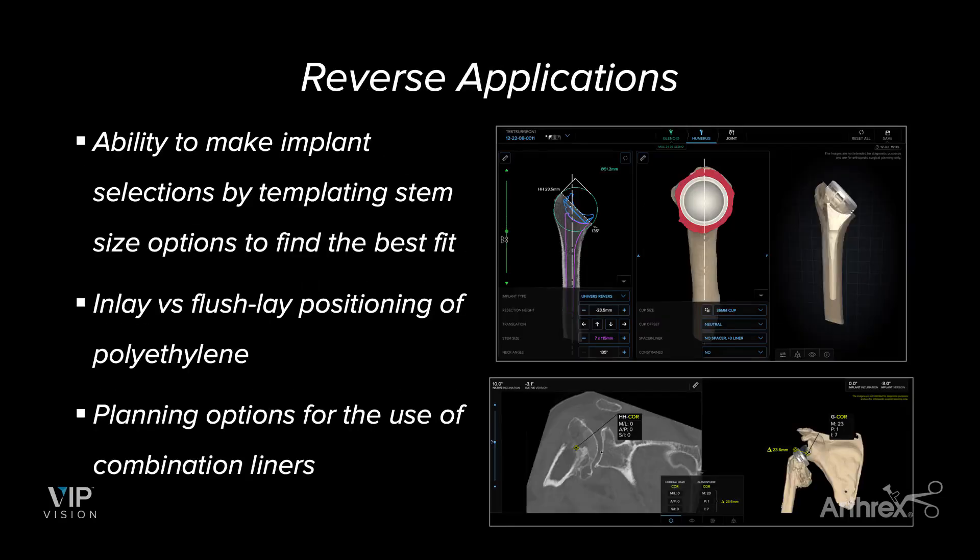Even in terms of reverse applications, it helps you understand which size you should be using for your stem, whether it's a short stem or a long stem. It can also tell you how deep you want to inset that stem, so you can have an inlay or a flushlay position of your component. And for smaller or bigger patients, or if you're using combination liners, it helps you figure out how big of a cup you want to use to better inset that component. Very important for a better surgical plan, better outcomes, and an easier time at surgery.